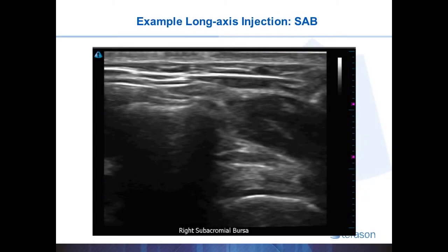Here is a video clip of a subacromial bursa injection done in long axis. What we see on the image is the hyperechoic subcutaneous tissues of skin and fat, a rather thin hypoechoic lateral deltoid muscle. The hyperechoic line here represents the lateral acromion with the posterior acoustic shadowing below it, since we can't see through bone.